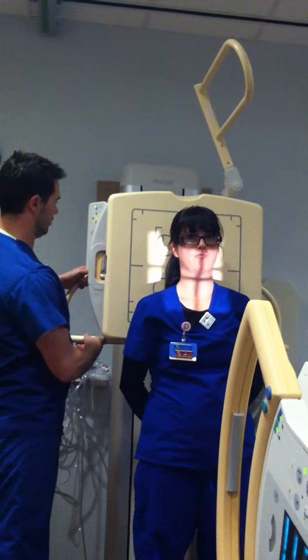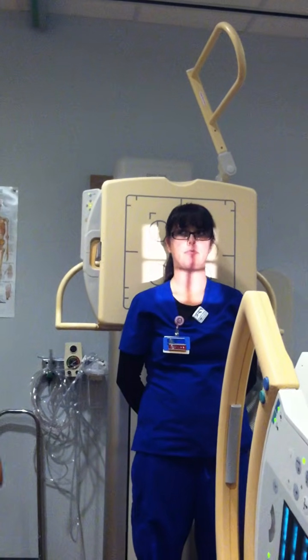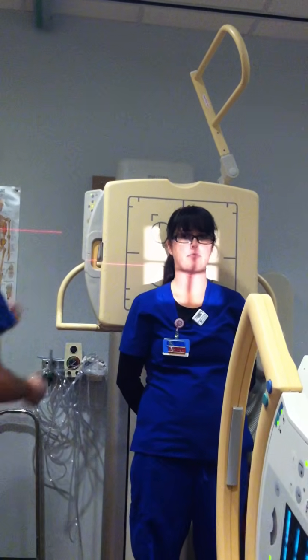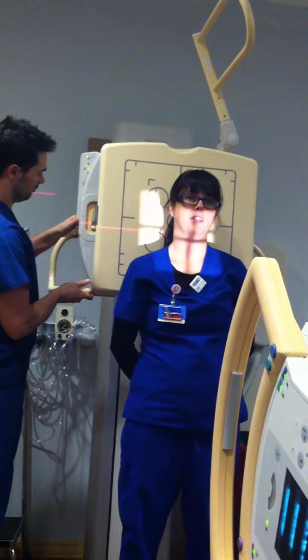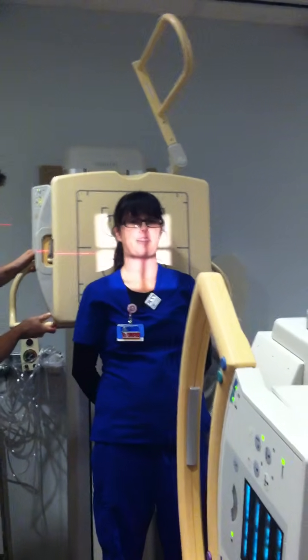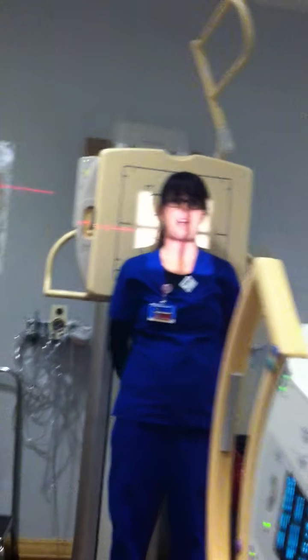So why do we have an angle on this one? First of all, how much angle do you have? 20. Okay, and why? Because she's standing. What are we looking at, the intervertebral space? The zygapophyseal joints are on the lateral. For the AP, the intervertebral space, right? No, we're going to do obliques. Yeah, angled, because your foramen are angled.